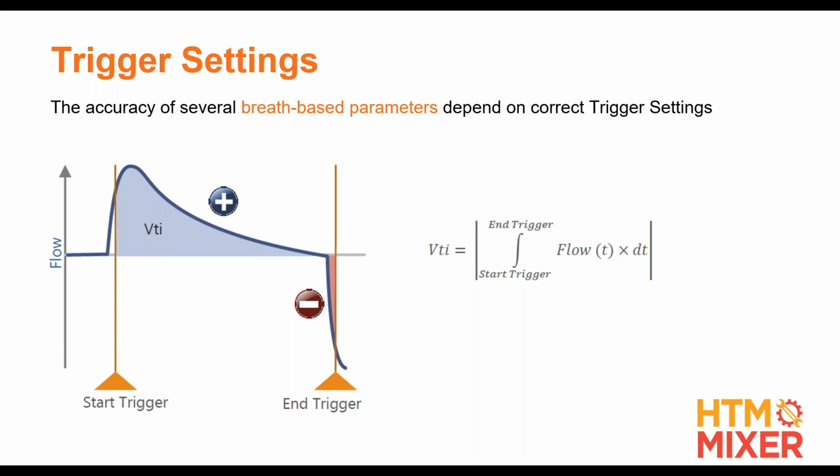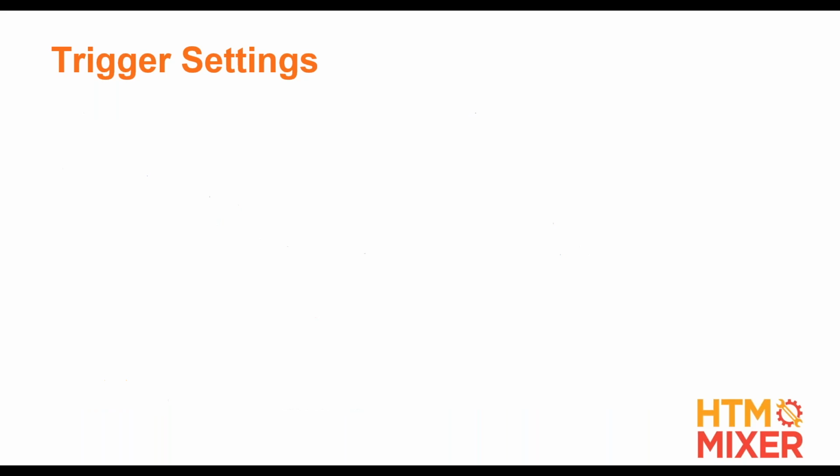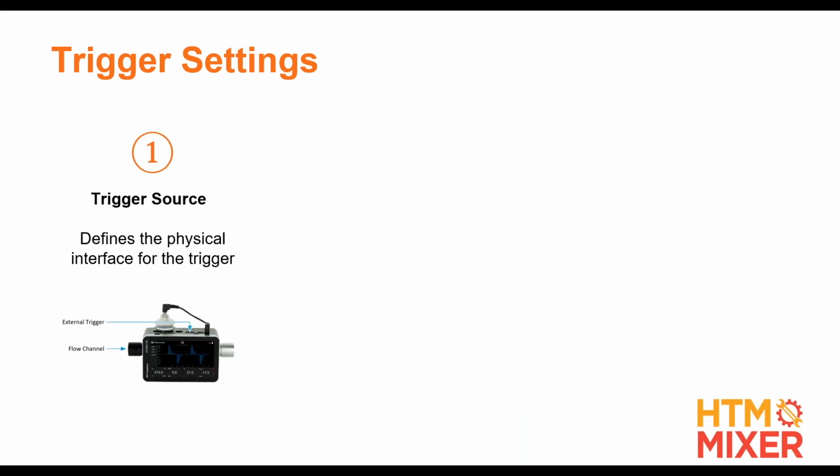So now our tidal volume, the ventilator's telling us we have 560 or 500, whatever, we'll just use 500. And now we're looking at something less than 500. And we're saying, well, how can that happen? Why am I measuring less? Well, it's because you may not be triggering soon enough or on a clean signal. Okay. So trigger depends on really 3 things.